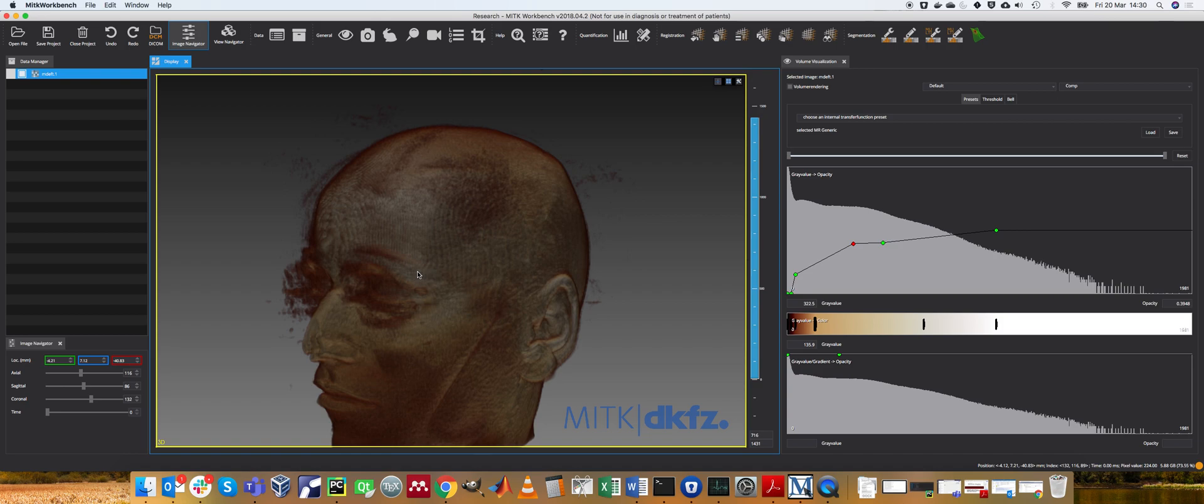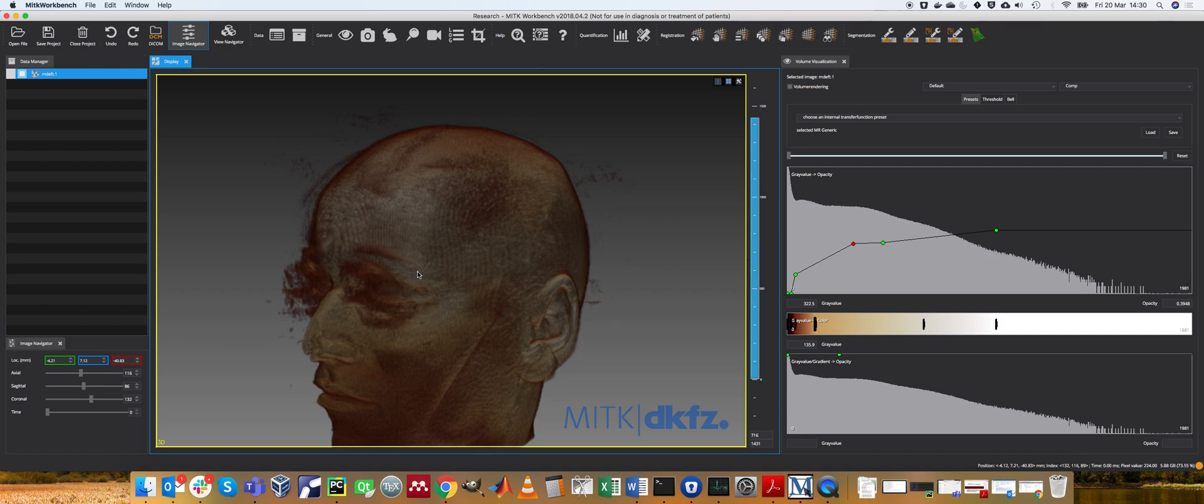But when it comes to actually displaying things in the OR, it's a very difficult visualization to control. So as long as you've got some nice default settings it would be quite useful. But I can't imagine people fiddling around with this too much during a procedure. It would simply take a lot of time.